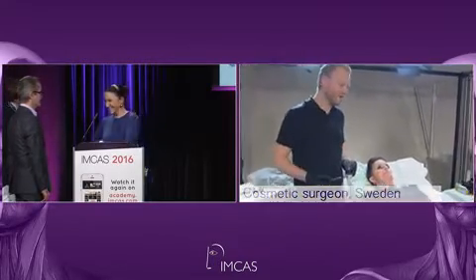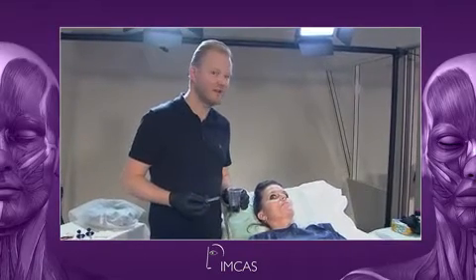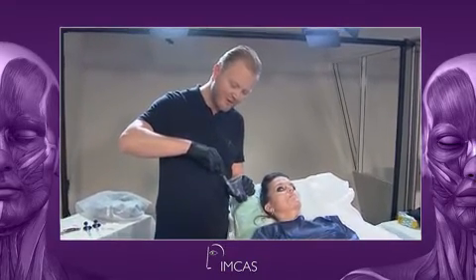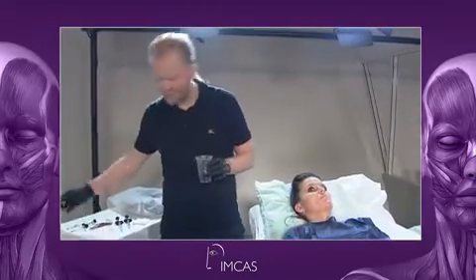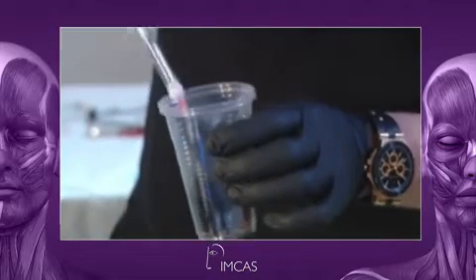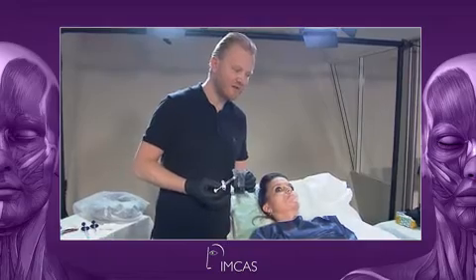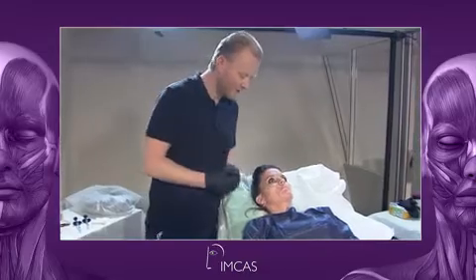Go ahead. We have a difficult patient, and what I wanted to show you before is that when we use higher viscosity gels, I think we need to be careful because we do a lot of false aspiration. So this is just to show you, even if I do a long aspiration like this, there is nothing coming back. So let's try a really low viscosity gel, as this is Vital. If I do a short one, nothing comes. So we really have to stay for a long time when we do aspiration. Remember, aspiration is not 100% sure, and unfortunately we've seen some intravascular compromises in the perioral region.